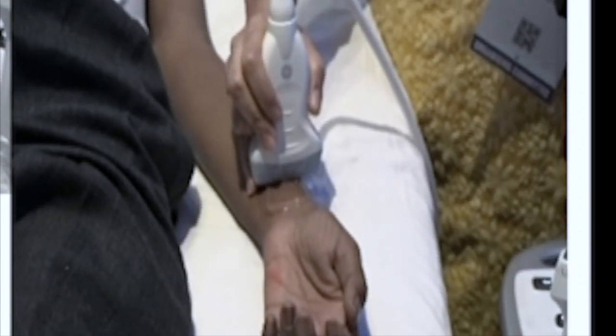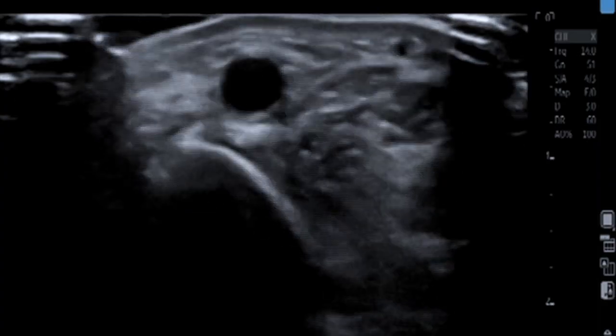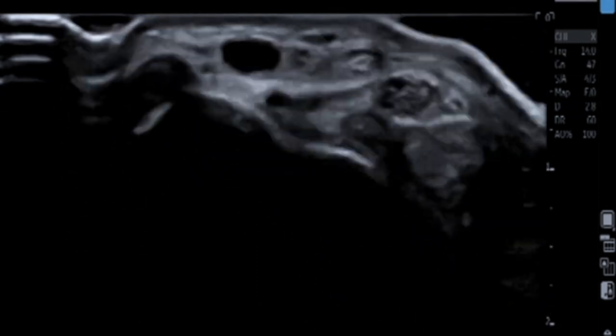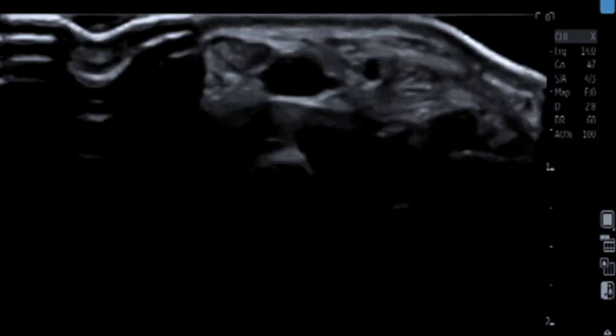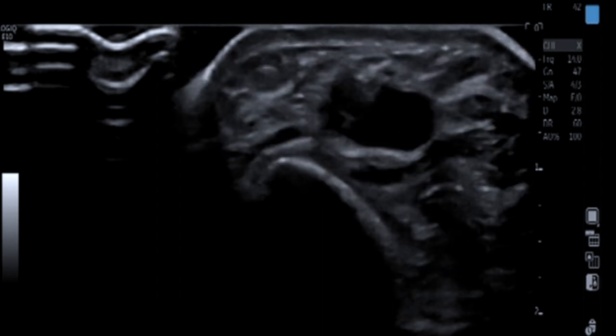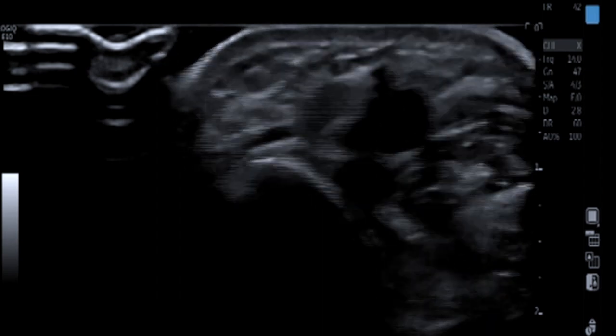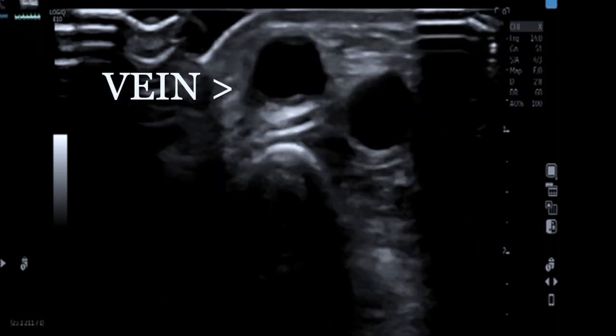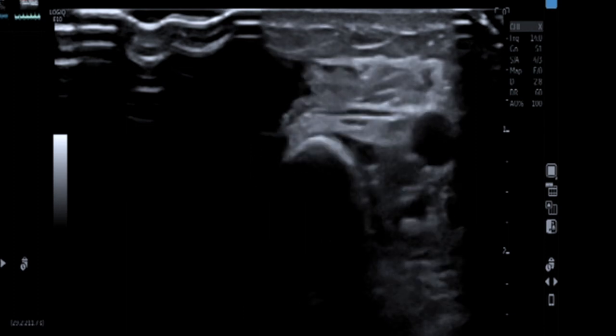Here we have a gentleman with a distal radiocephalic fistula. You can see the scar, and what we now start doing is a good B-mode evaluation. Remember, a good B-mode is important before switching on color — evaluate from caudal to cranial. Here is the radial artery which I am tracing. You can see the anastomosis and the draining vein, which continues proximally.